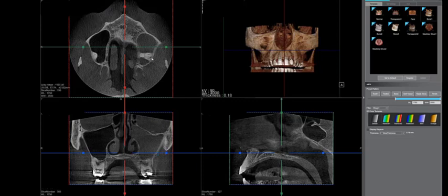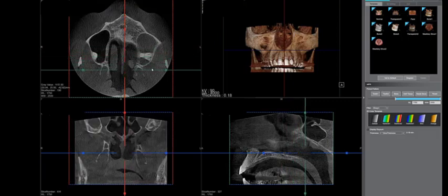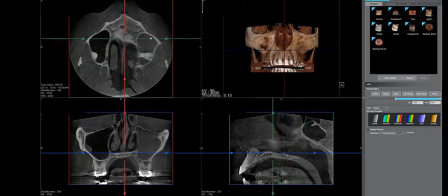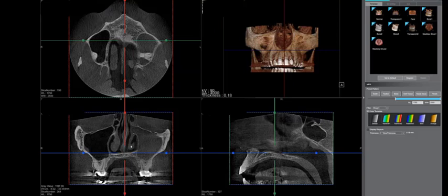Yeah, this is a great example, and I'm curious, what were the symptoms of the patient when they first came in? Just kind of congestion, pressure in the sinus. It just doesn't feel right. Right, not necessarily acute enough to move them to action. But if you ask them about it when they're sitting there, they'll say, oh yeah, something is kind of weird here, but I'm not sure what. The right and left maxillary sinuses are very different in him.